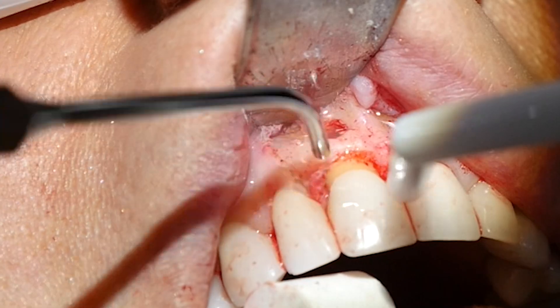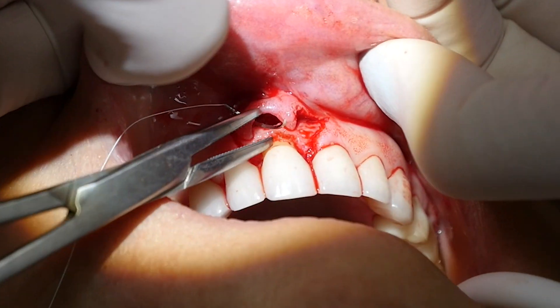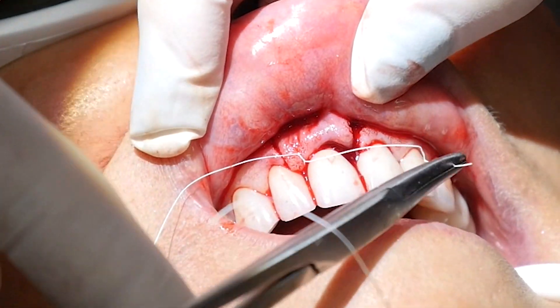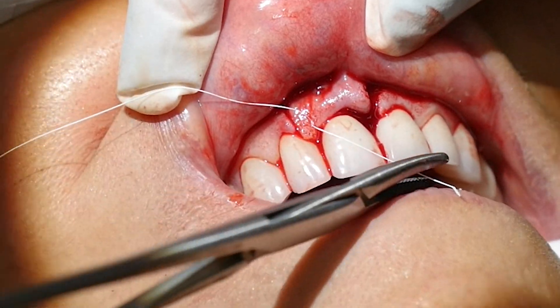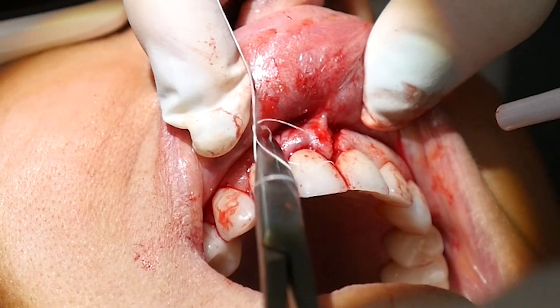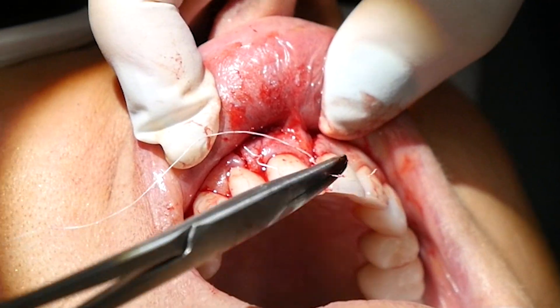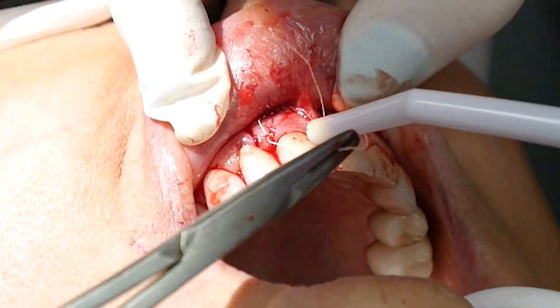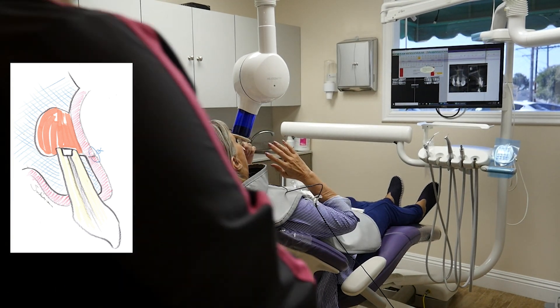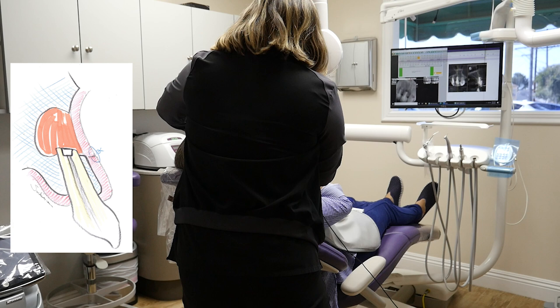After irrigation with ozonated saline, the gums are sutured back in place and an x-ray is taken. Thank you.